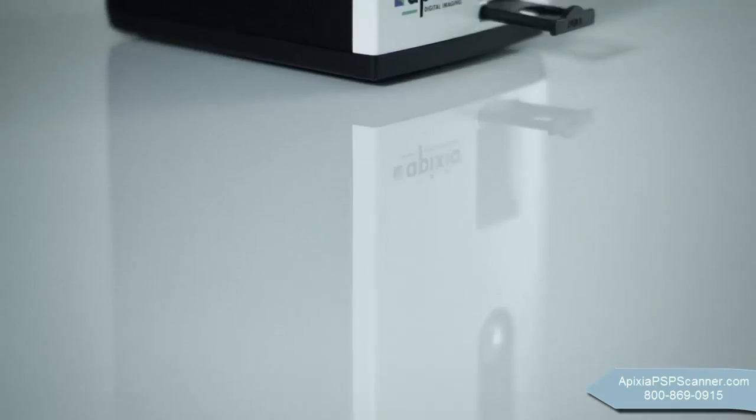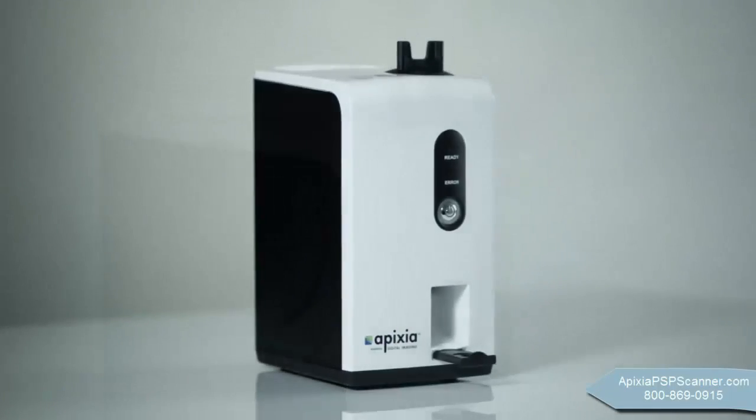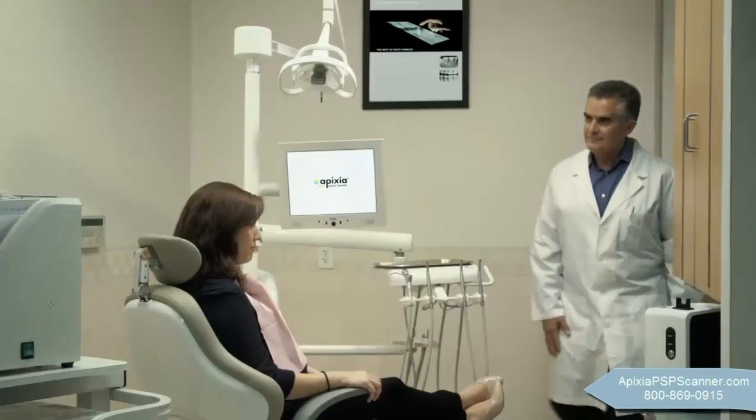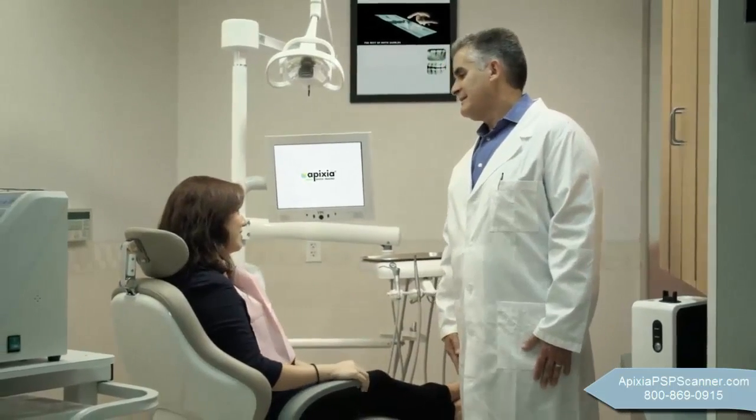The Digirex PSP Scanner packs tremendous imaging power into a small package. Tiny enough to fit into the most crowded dental operatories, yet robust enough to be placed in a central location for use by the entire office. The Digirex PSP Scanner is the ideal product for any size dental practice.